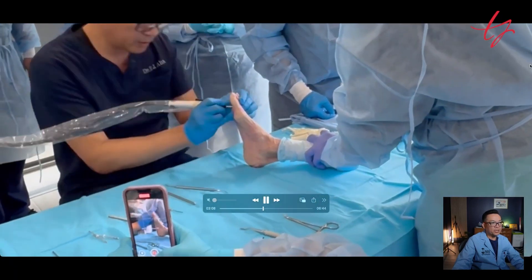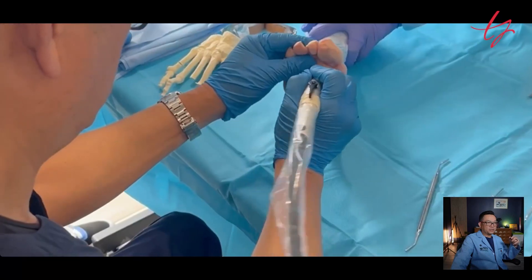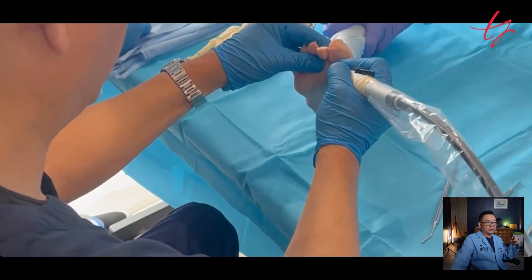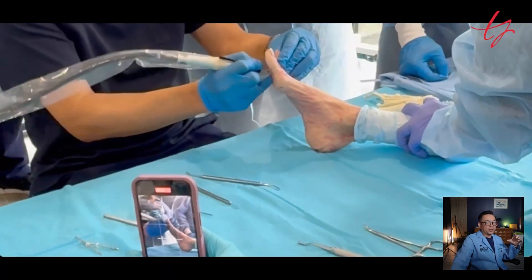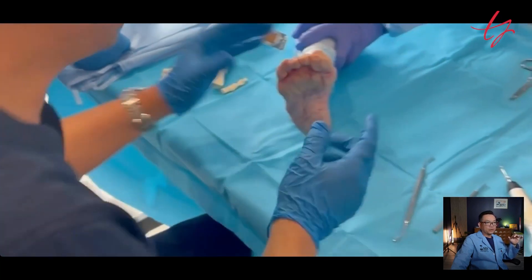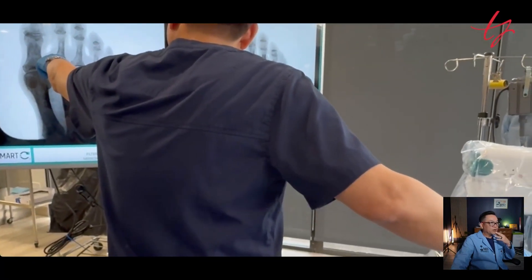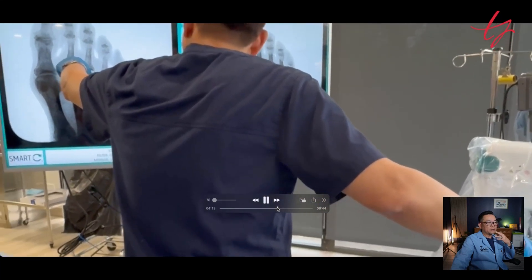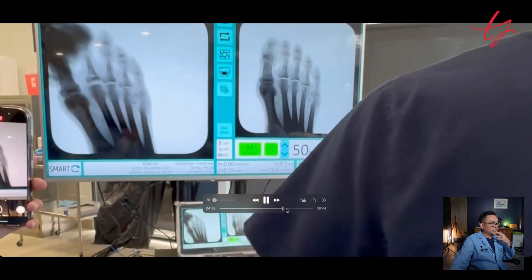These are the MIS drills now. Go from the medial aspect of the basal proximal phalanx and use a gentle in-and-out, carousel motion — sawing from medial to lateral of the basal proximal phalanx. The whole time you have to feel it by relaxing your hands, not speeding up, and utilizing the torque of the MIS drill set so that you don't burn bone — that's critical. Here under fluoroscopy I'm pointing out the osteotomy at the base of the proximal phalanx so you know exactly where you made the cut. You can see the cut right there at the base of the second toe.